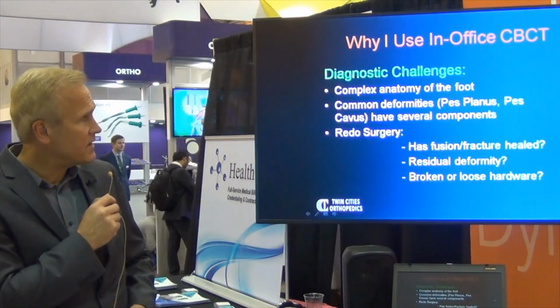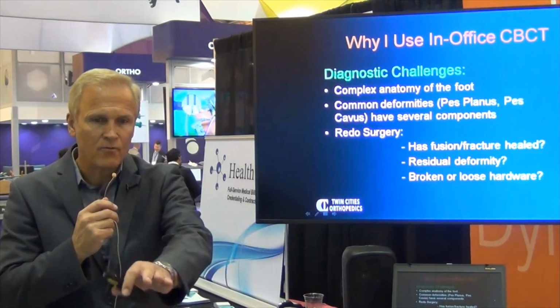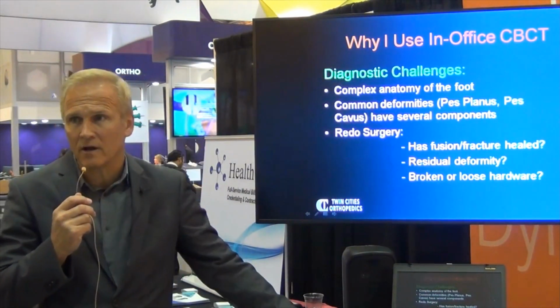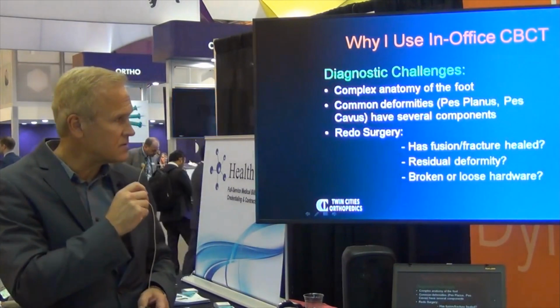We also treat a lot of common deformities, pes planus and cavus deformities, that are really dynamic deformities. So the weight-bearing part of the CT scanner is very important. We don't always know from just plain X-rays or MRI scans, which are not dynamic tests, whether we have ligament instability or a certain amount of cartilage loss. The weight-bearing view, especially with foot deformity, allows us to evaluate whether those ligaments, such as the deltoid ligament or the spring ligament, are actually stable. And if they aren't, then we'll see that on the 3D imaging or even the two-dimensional imaging on these weight-bearing CT scans.